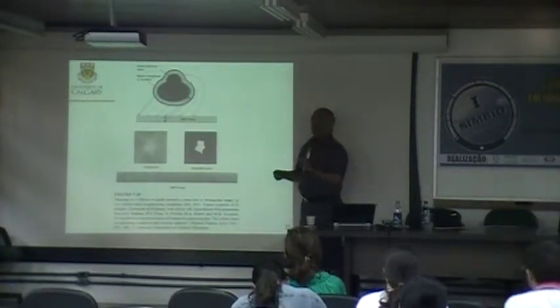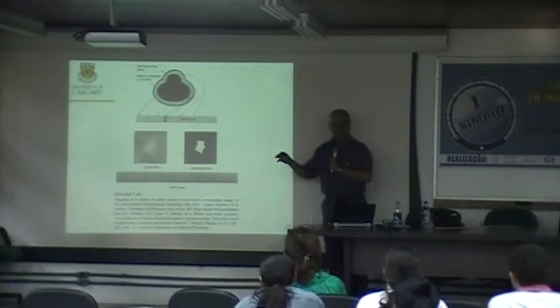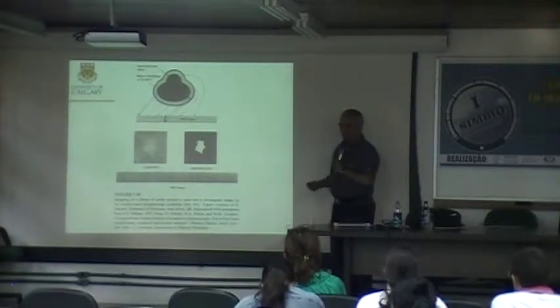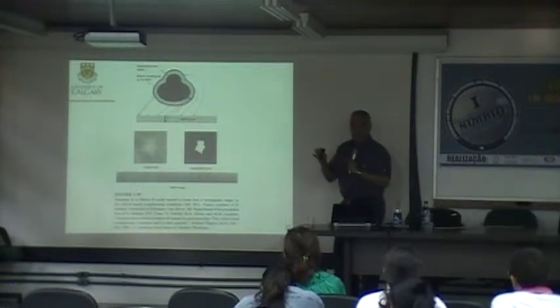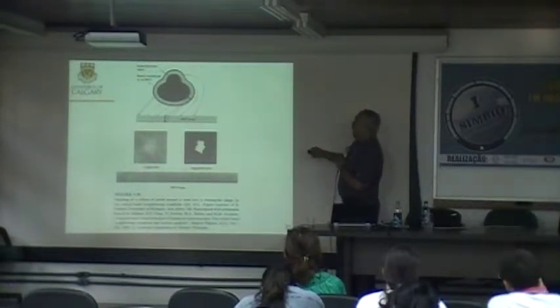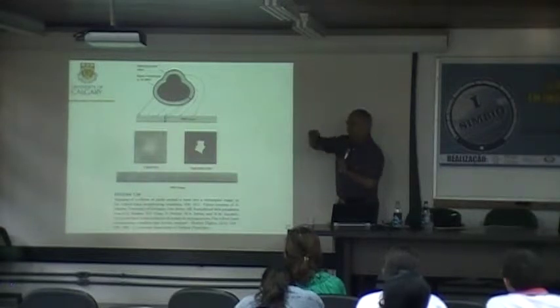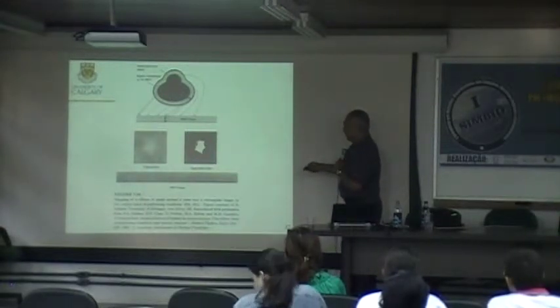Sahil and others proposed a transformation. We did not transform the ribbon, we just left it the way it is in the image and computed statistical measures, including texture. Sahil said, if this is the tumor, take so much of the ribbon inside the tumor and take that and stretch it, make it a rectangle by geometric transformation.